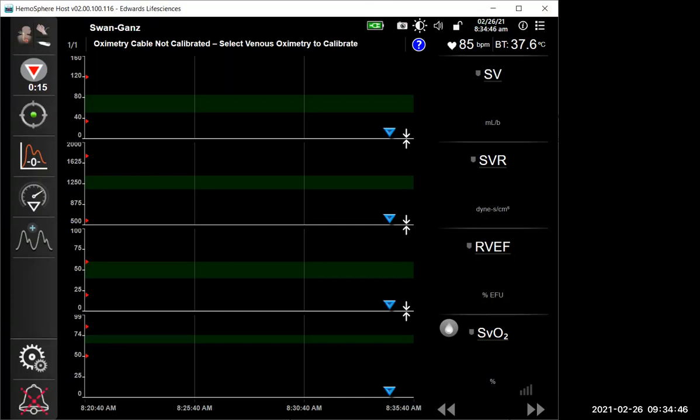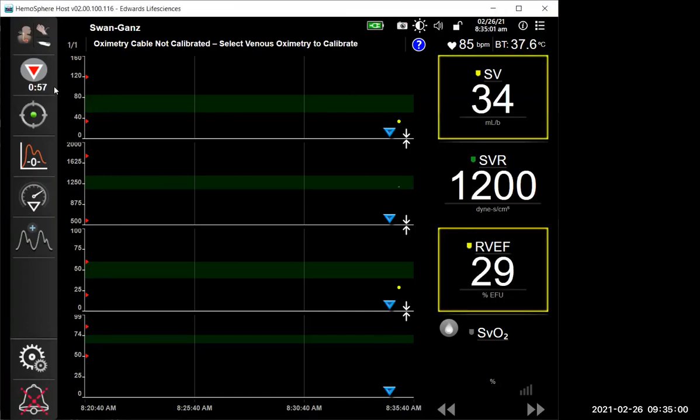Let me make sure I have some numbers you're going to get back here. Hold on. Yeah, we'll get some numbers, I think. I'm used to using FlowTrack, so it pops up a lot faster. Okay, so that's just how you would mark interventions on this.